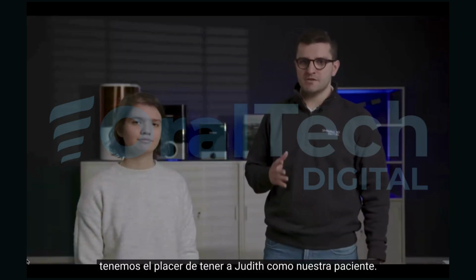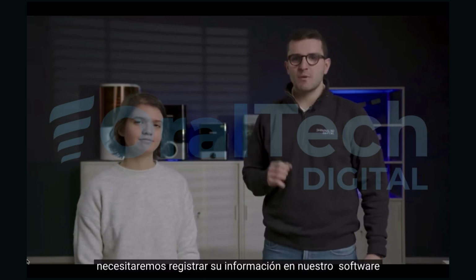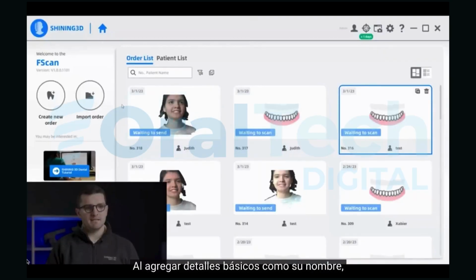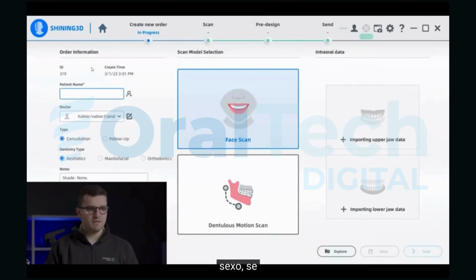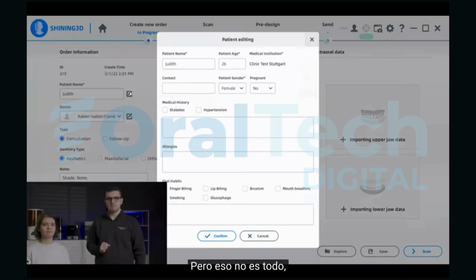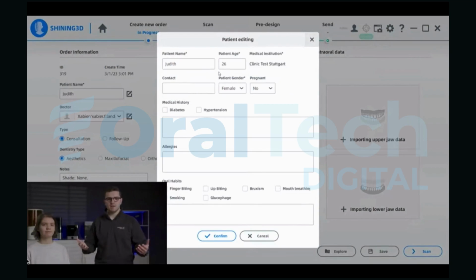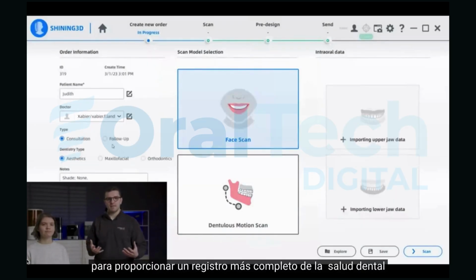Today, we have the pleasure of having Judith as our patient. To get started, we'll need to record her information in our software. By adding basic details such as her name, age, and gender, a new patient can be created in a matter of seconds. But that's not all. We can also add more detailed information, such as medical history, allergies, and oral habits, to provide a more comprehensive record of the patient's dental health.